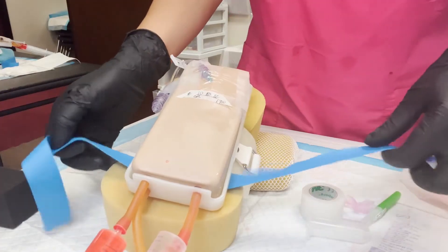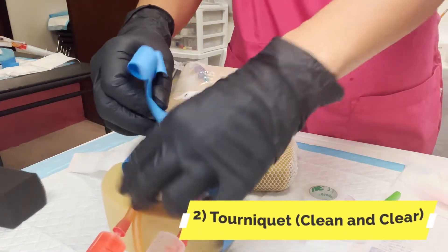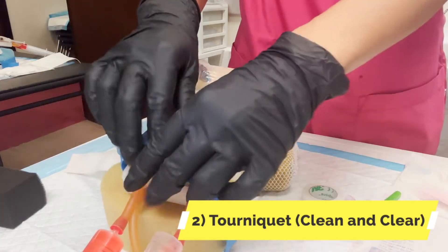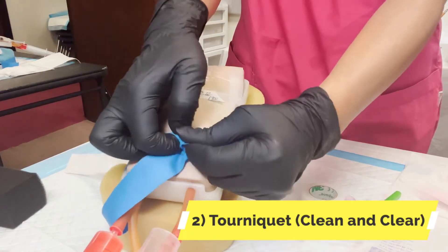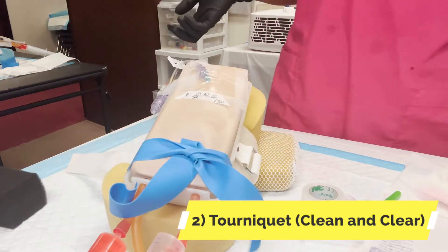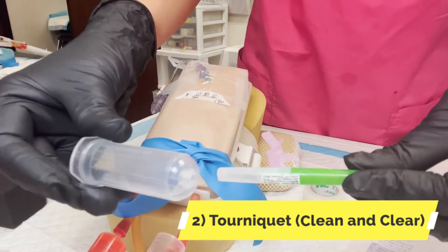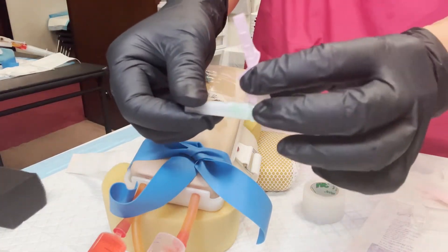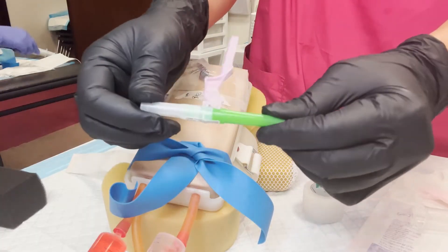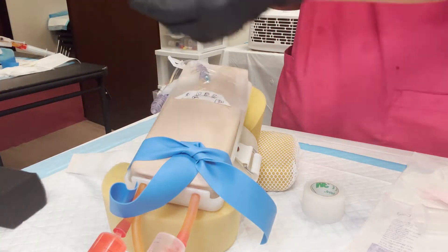It's time for me to take blood. Whatever's under, and top on top. We take off the clear right here — the white, not the green. The green is the needle, so be careful.